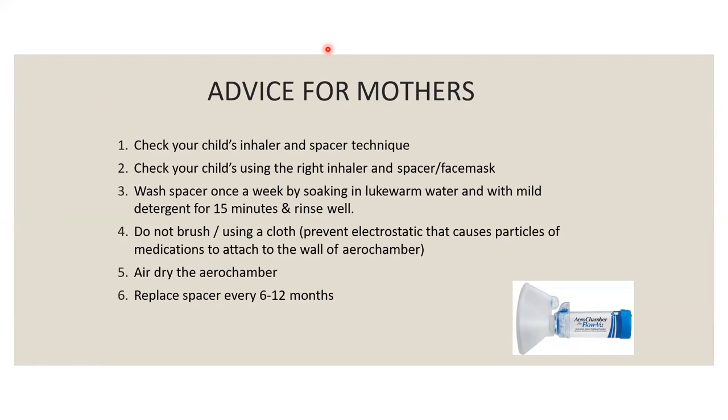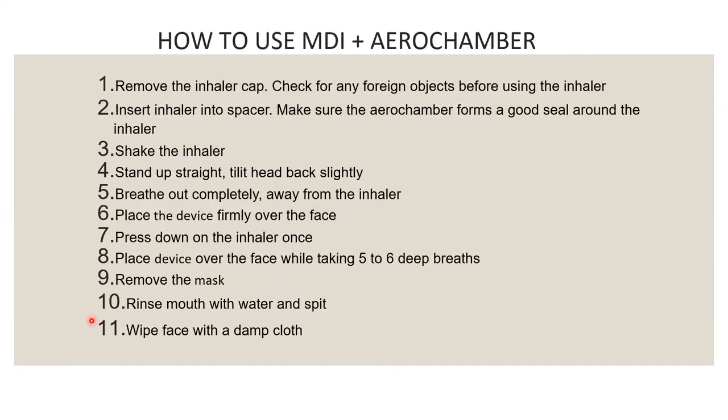Acceptable. Anyway, any questions on MDI? So what is the age for you to shift from the spacer, from the face mask, to the mouthpiece? At what age can you start using the mouthpiece?